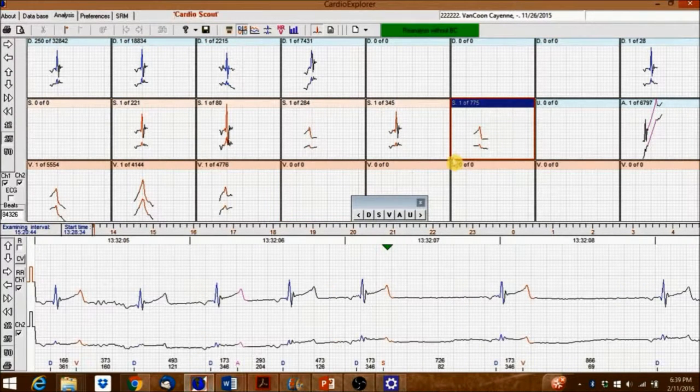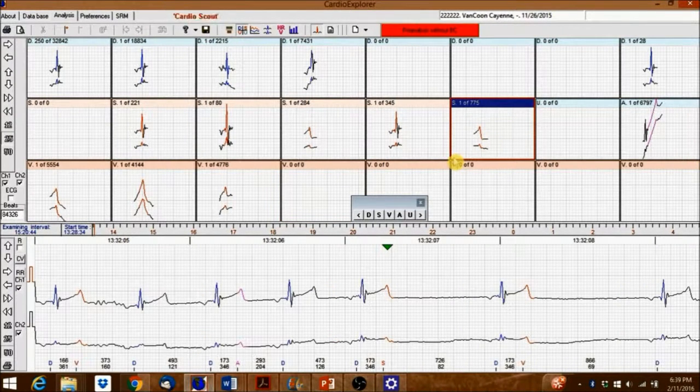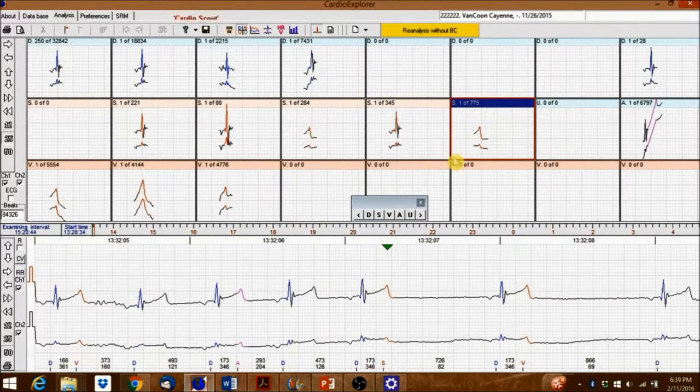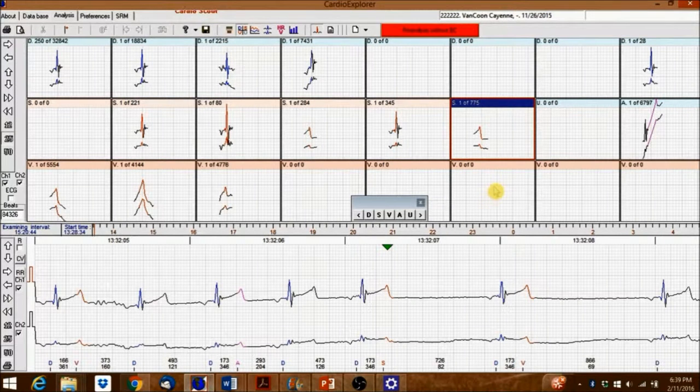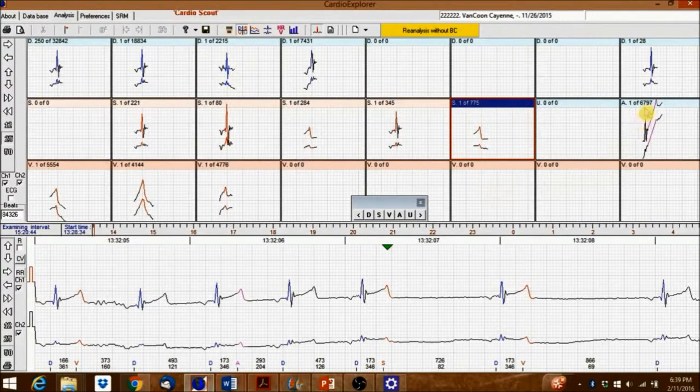Beats dragged into the artifact box will be removed when you perform a reanalysis of the ECG.